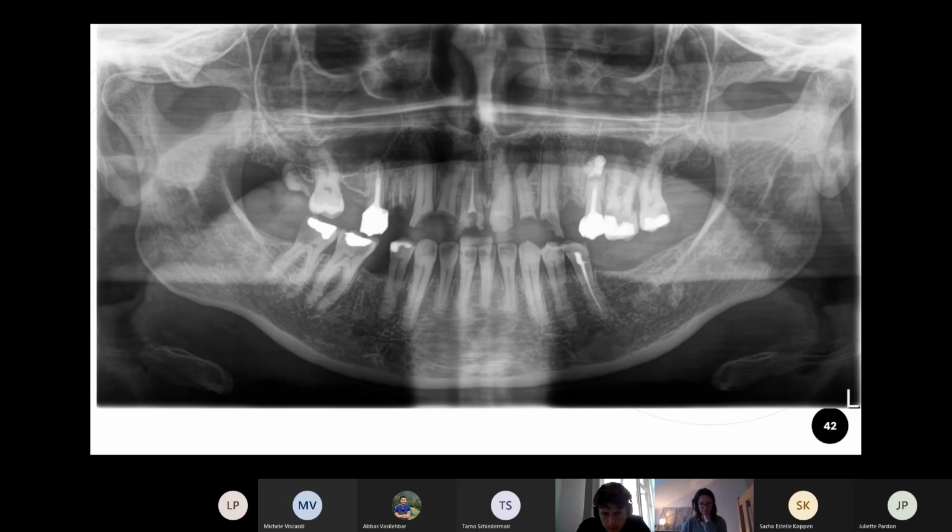The incisors, there's some radiolucency in the incisal part. It could be that there's some filling, radiopacity, I mean. Maybe it's a composite filling, but it's hard to see on an OPG usually. This you would have to check clinically in the mouth. Number 4 is a composite, could be with some caries, but it's hard to see on the OPG.